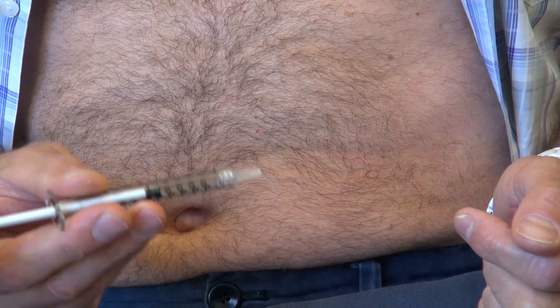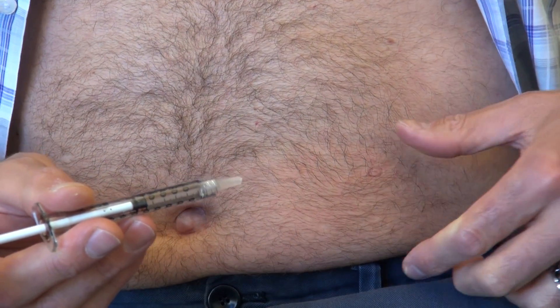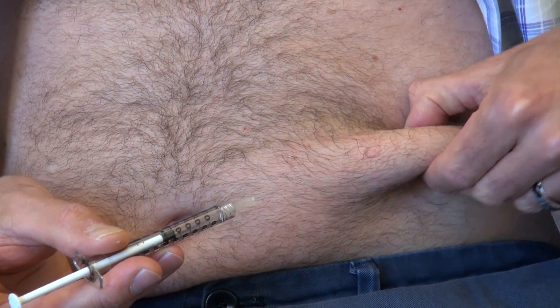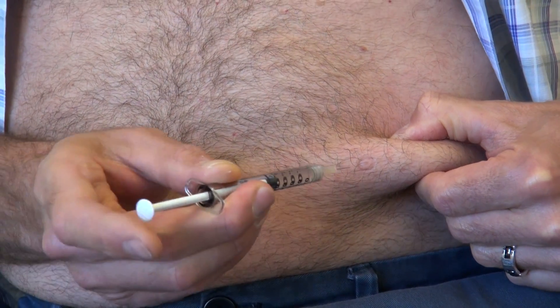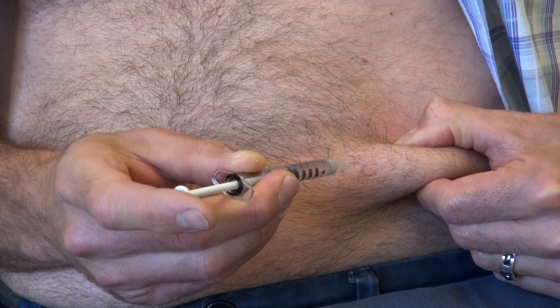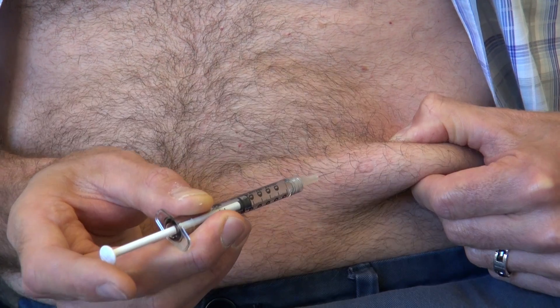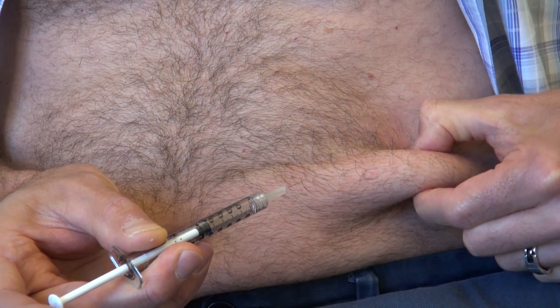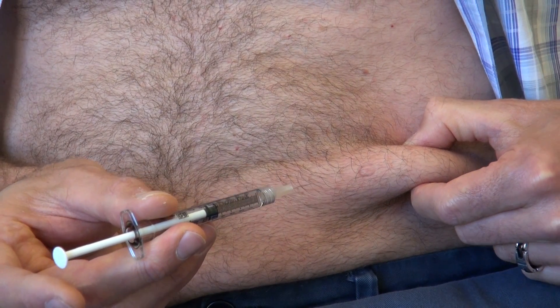Longer needles are not typically prescribed because they're psychologically less comfortable. Pull the skin outward away from the belly, brace your arm on the opposite side, and use your wrist to enter in one smooth movement — get as close to the skin as possible and enter in one motion. Don't peck at the surface, as each touch causes a prick. Grip the pinching hand firmly to cause some distraction — once the needle breaks through the skin, there's no pain as you slide in.